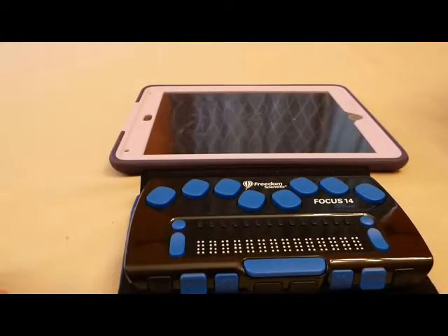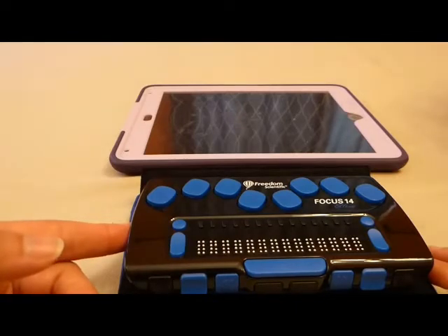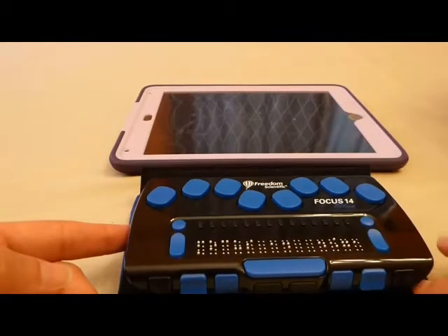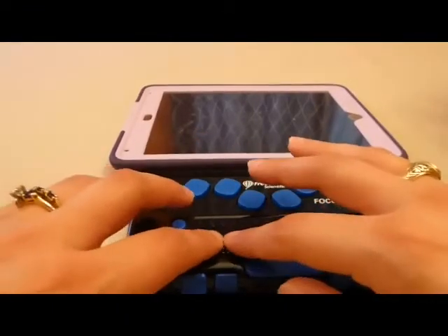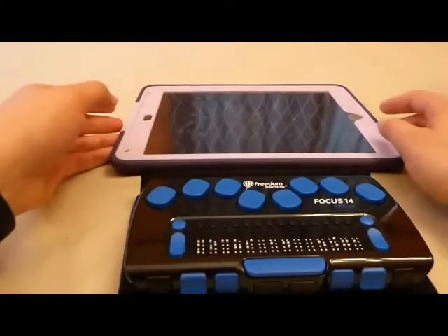Now, I would like to demonstrate how the Focus interacts with the iPad. First of all, I'm going to turn the Focus on by holding the power button on the left side for three seconds. I will know it's on when Braille pops up. While the Focus is not paired, it will say Focus 14 on the front. If I pan on my Focus 14, it will give me my battery charge. On the 40, you don't have to pan — the battery charge will already show up in the middle.